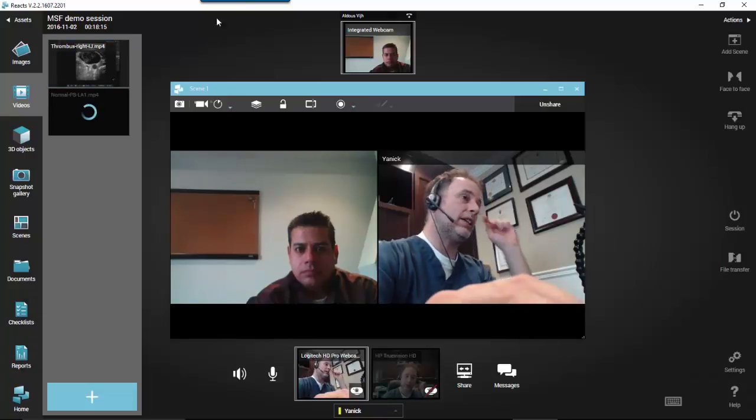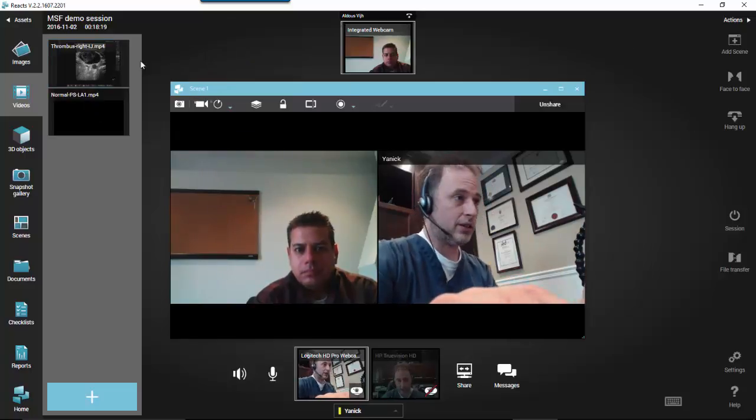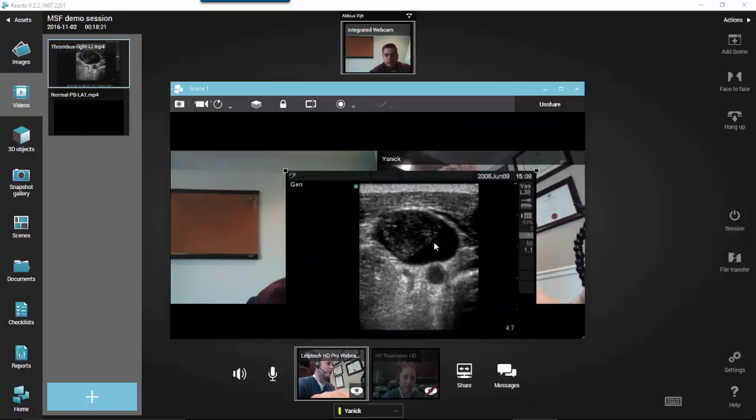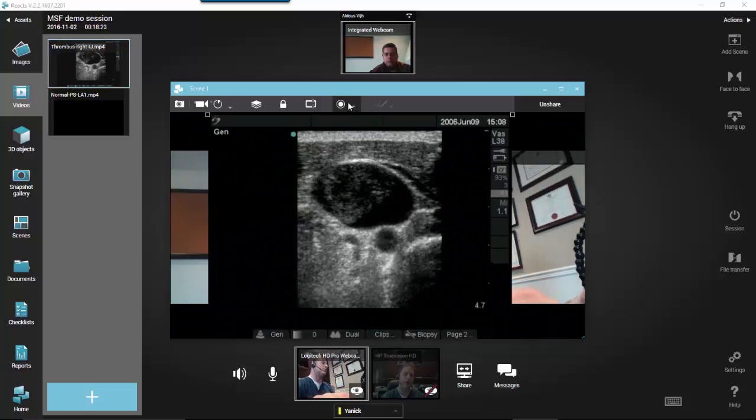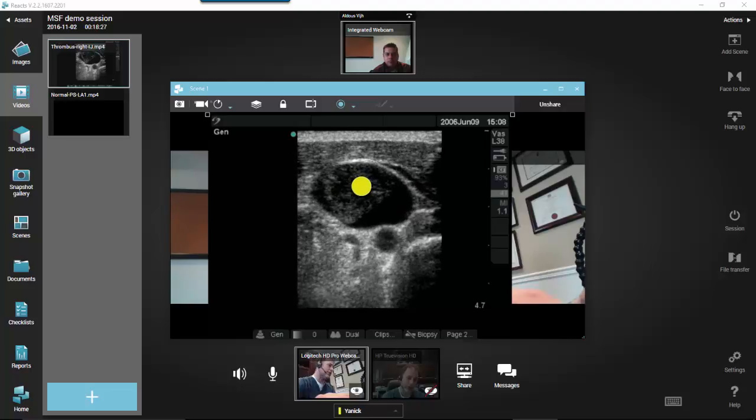As soon as the clip is ready, I can take it and either open it in a new scene, or just drag and drop it. And now Al and I can both see that clip. And I can tell him, look at this big jugular vein with a big clot in it.